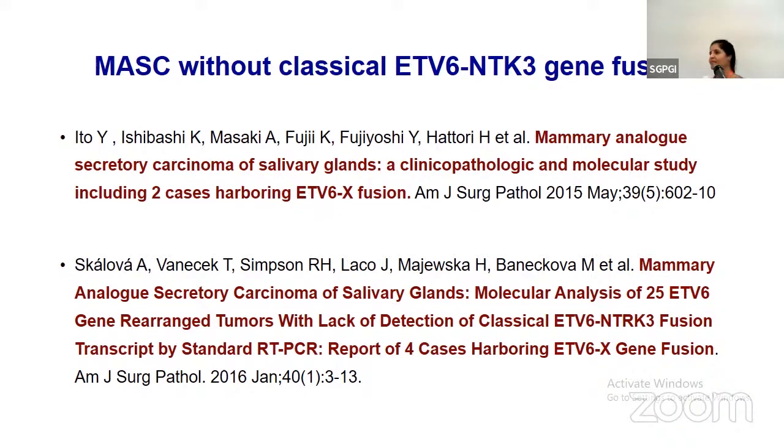Very interesting. The lesson learned is that if you have a tumor of this type in the thyroid, please go for IHC first. Right, truly said. TTF should always be done whenever there is such a situation. And apart from cribriform morular, which is now, in the new WHO, no more considered a variant of PTC also, so it can be another thing that could be thought of.